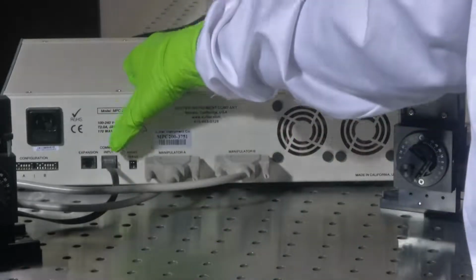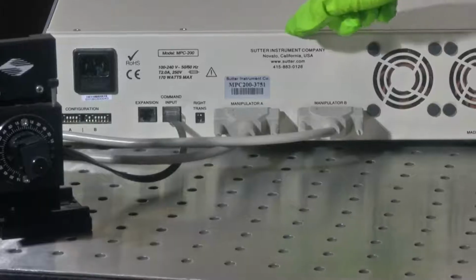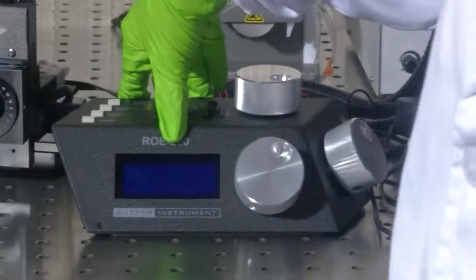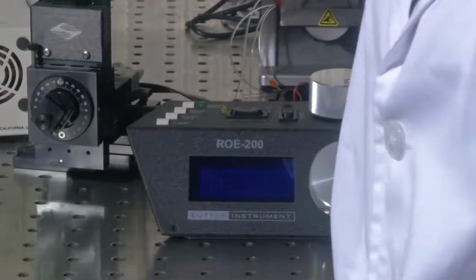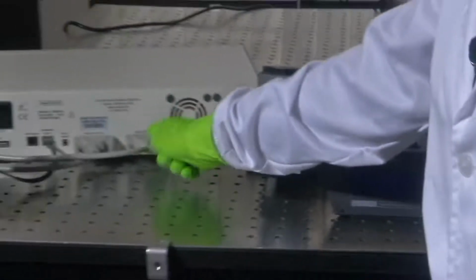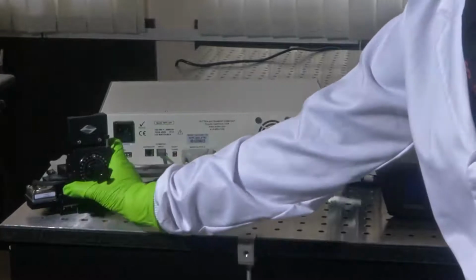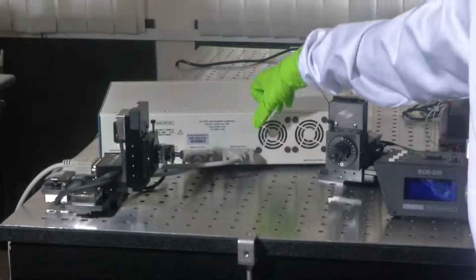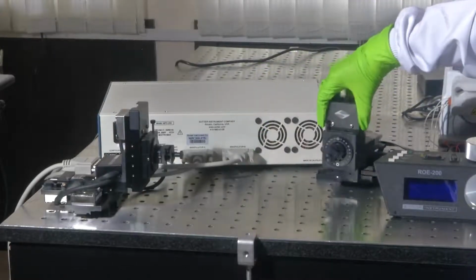So, this is the command input, the RJ45 cable which goes from the main unit to the control unit, and then the main unit has two ports here, manipulator A which goes to the manipulator here, and manipulator B to this manipulator here.